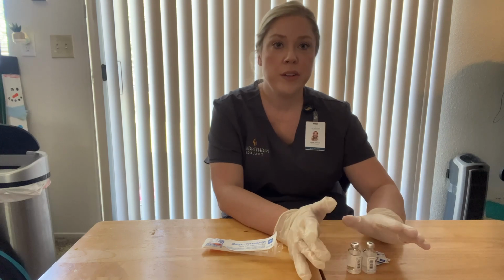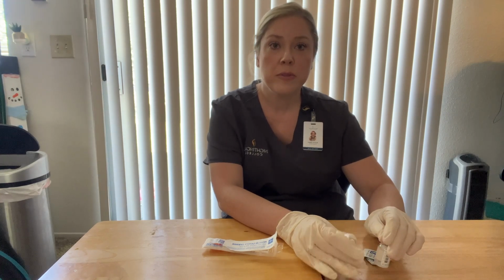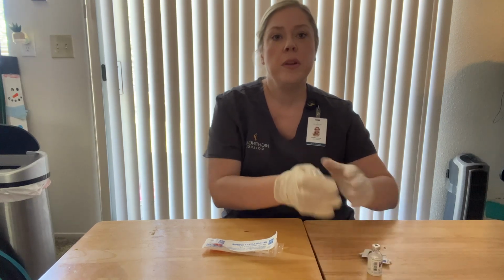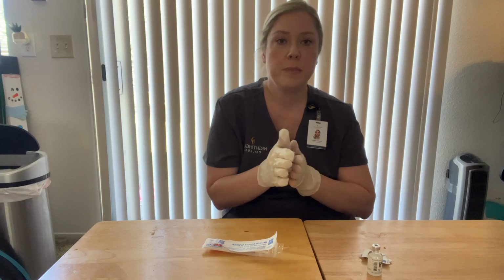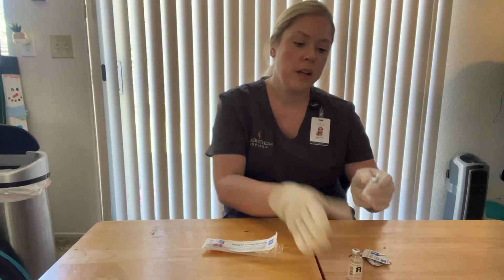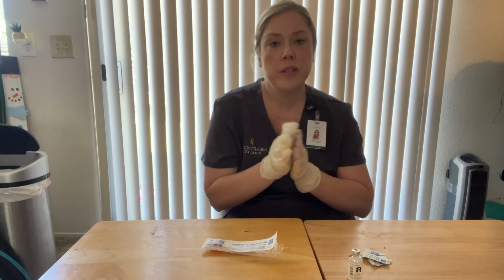I would prep the medication by calculating the total volume of insulin needed. So today we were ordered 4 units of regular and 8 units of the NPH, so we'd add those together, which would be 12 units total volume. I would go ahead and have another RN verify my calculations before I actually started withdrawing that medication. I would then want to roll the vials between my hands. This just helps resuspend the medication and also get it to room temperature if it was refrigerated.